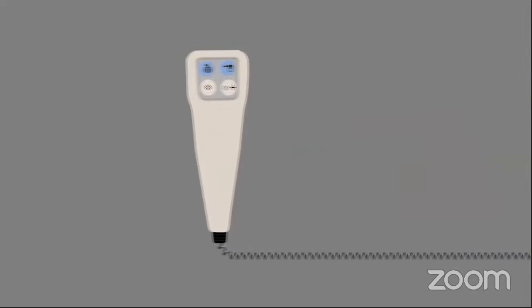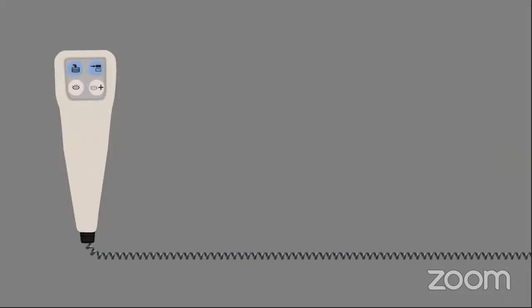If the work you're doing doesn't require you to interact with the patient during radiation exposure, we suggest you take advantage of the full length of your hand or foot switch cable and stand back.